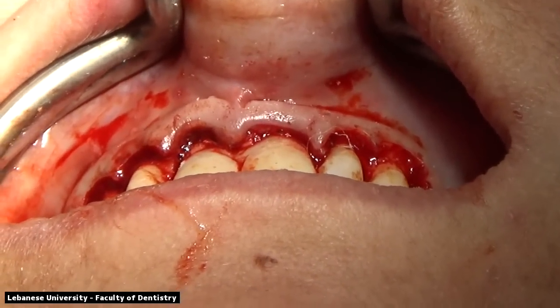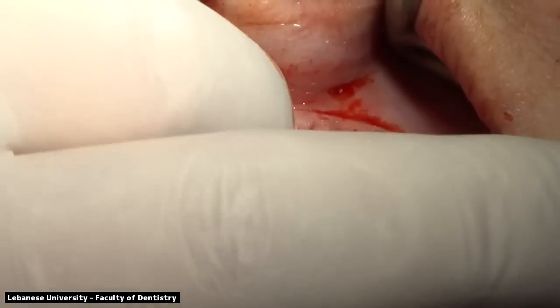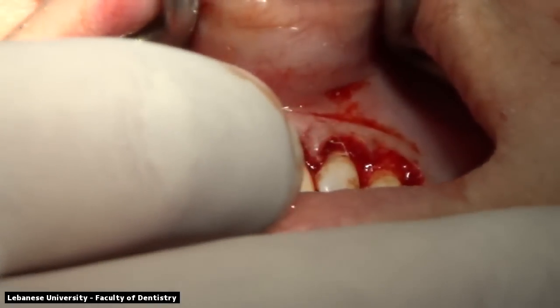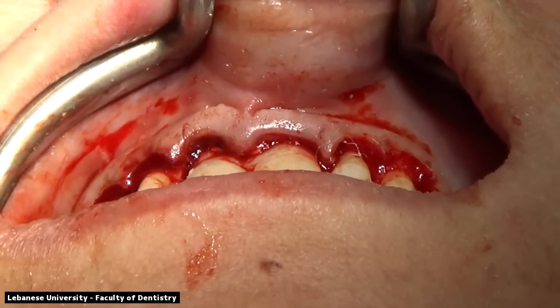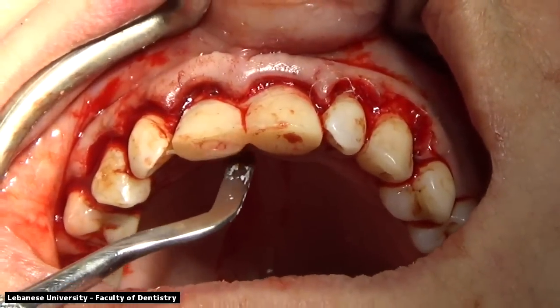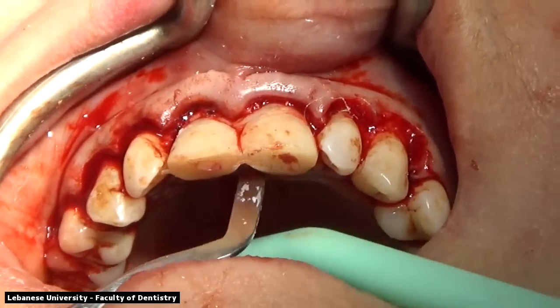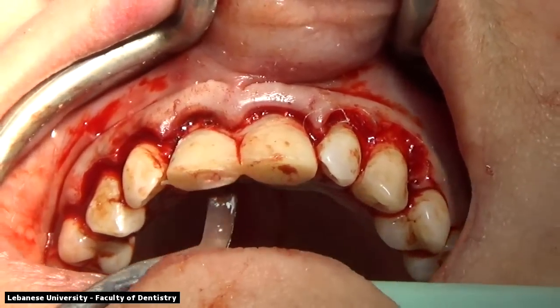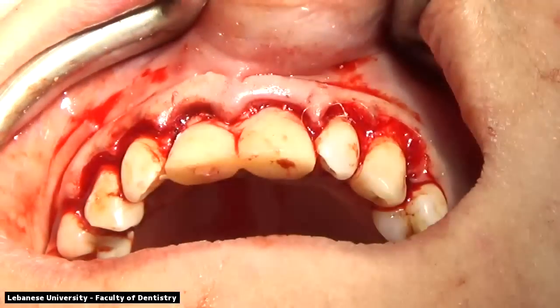The margin of the abutment on both the buccal and the palatal aspect have to be completely flush with no openings or overextension of this acrylic material. We check our opening to make sure that there's no excess material coming out from the palatal side, and to adjust the finish lines on both the temporaries from the palatal aspect.